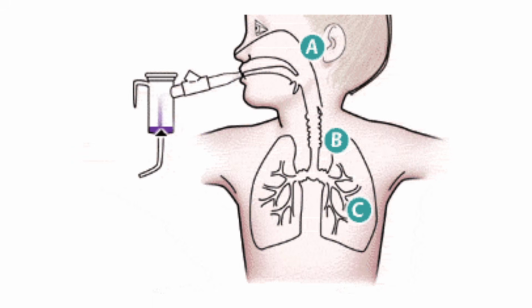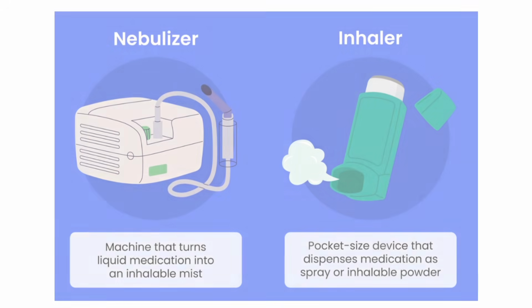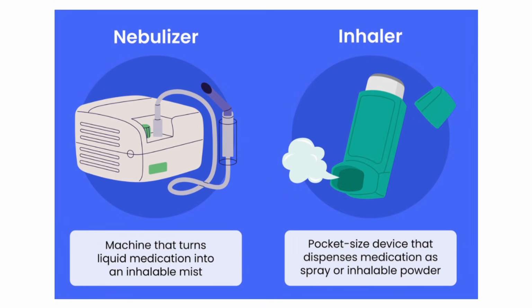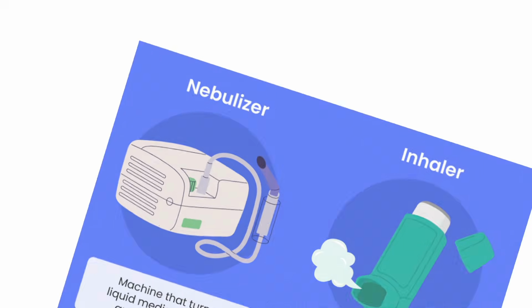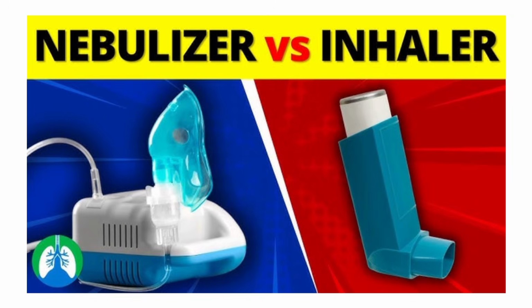Mainly, this nebulizer is used in people who can't use inhalers effectively, like young children and very elderly people. They can't use the inhaler properly. So, in those conditions, a nebulizer is advised.